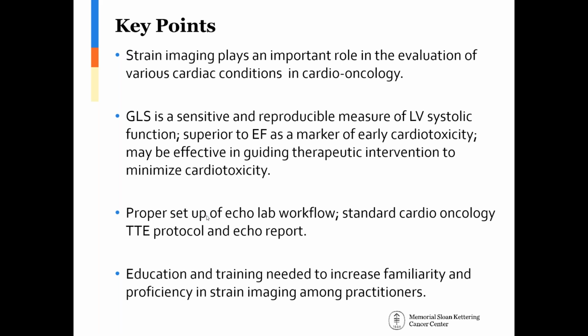that are available for centers to download, do the analysis, and go back and forth with us with feedback to help standardize strain measurements at the different centers, and we'll go live February 1st. So we are finding ways to try to standardize strain measurements. But I think the key is, like Jennifer said, getting everybody on board.